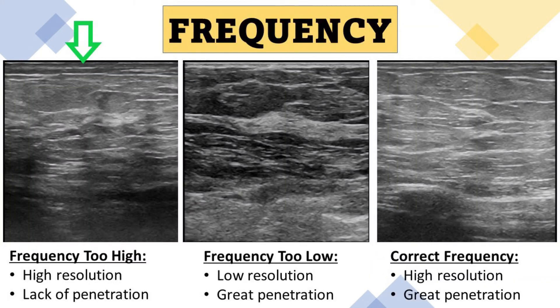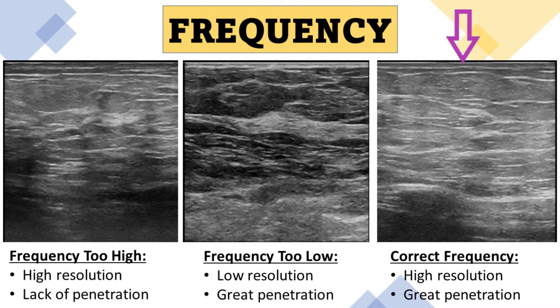In the first image, the frequency is set too high, giving high resolution in the tissue but a lack of penetration down deep to the chest wall. In the second image, the frequency is set too low — there's great penetration all the way down to the chest wall, but it's a low resolution image and you can see the image is much grainier. In image three, the frequency is set correctly, giving both high resolution and good penetration all the way down through to the chest wall.